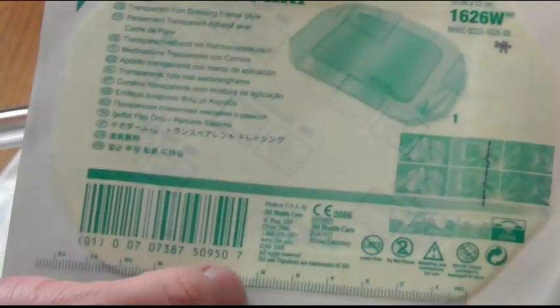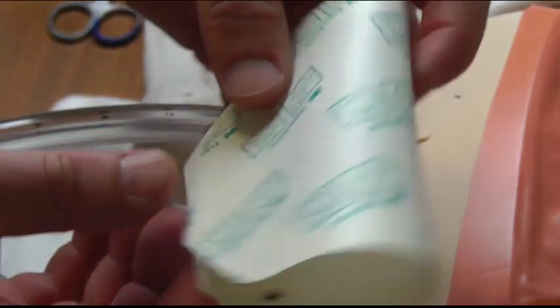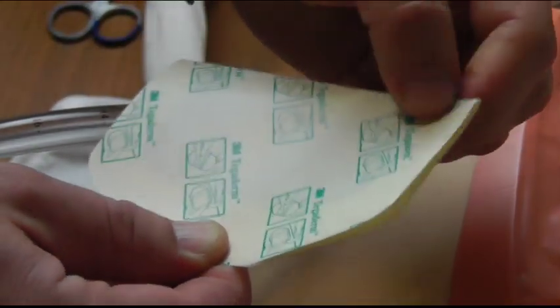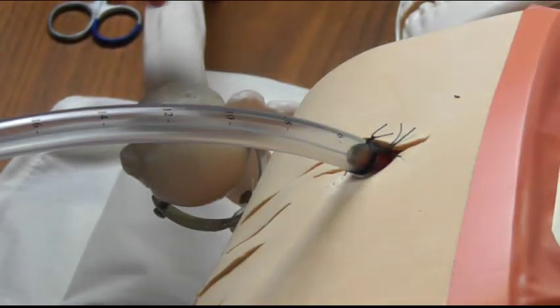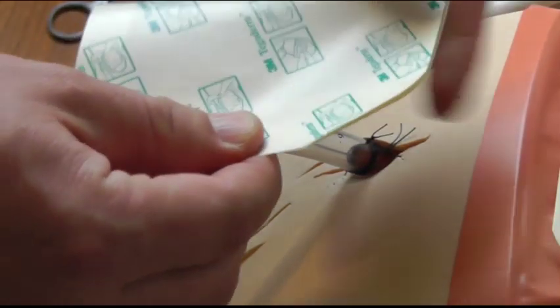What you then need is a couple of tegaderms. I just use these, the large tegaderms. These are 10 by 12 centimeters. Again, not fussed about brands. These are good because of this cardboard edge they have around and you'll see why in a moment. So what you do is you take a couple of these out of their packets and what you want to do is fold them in on themselves. So with the backing facing out, fold it in half and just make a bit of a crease. Grab the other one, do the same. I often prepare these in advance before I start putting the tube in. So they're sitting there out of their packets already folded in half.